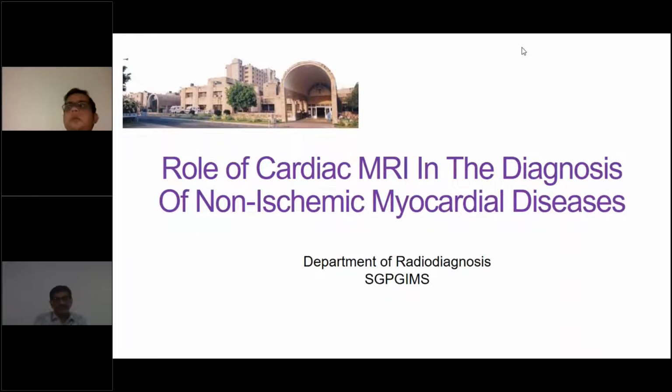Dr. Neeraj, Dr. Srishti, and Dr. Tanya from the Department of Radiodiagnosis will present today's clinical grand round on the role of cardiac MRI in the diagnosis of non-ischemic myocardial diseases. In this presentation, first we'll give you the overview of cardiac MRI pertaining to the non-ischemic myocardial diseases, followed by a few representative cases.